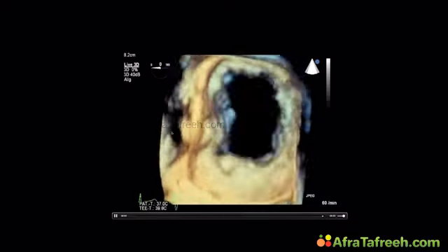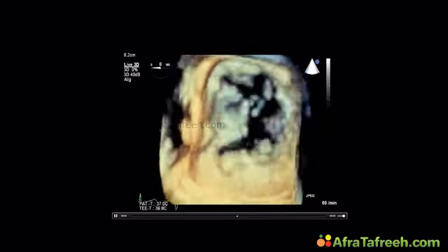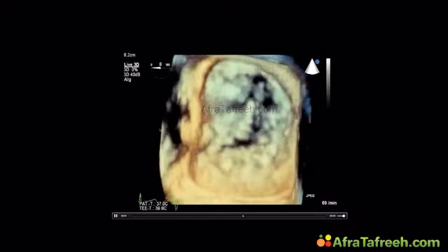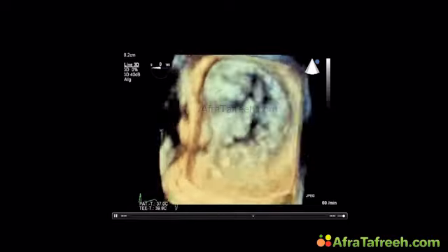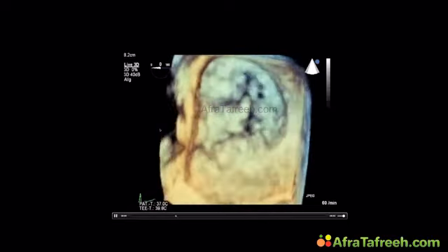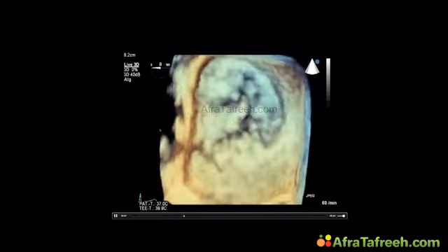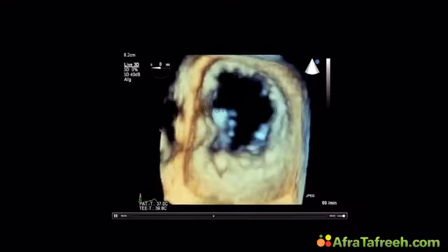Okay. I just got a question from Aurel. The question was, is MR holosystolic? I think you meant the patient that we saw previously. Well, it was holosystolic, but I would say that most of the regurgitation was happening towards mid and end systole. This is something you see very frequently in the setting of a mitral valve prolapse because the valve loses coaptation more towards the mid and towards the end of systole.